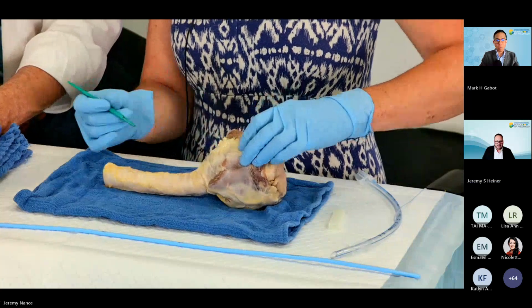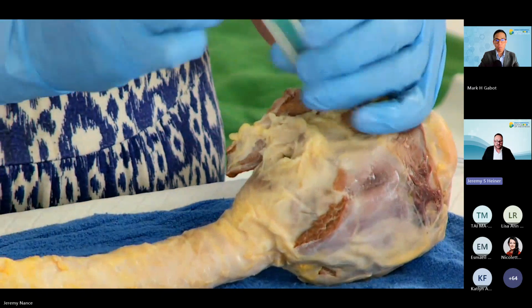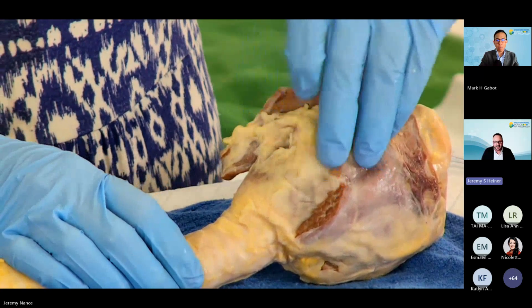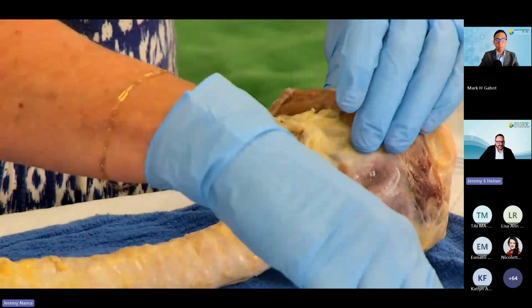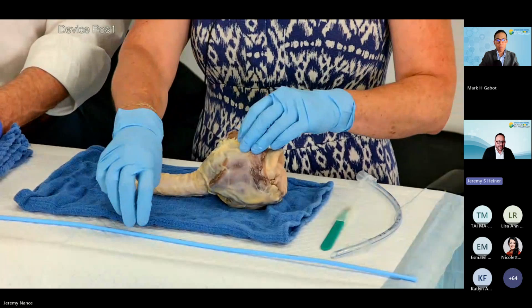You need a big enough incision to get your finger in. So go ahead and palpate now with the index finger of your non-dominant hand. And get that scalpel out of the way. The last thing we want to do is injure ourselves or anyone else. Now with that index finger, are you feeling all the way down the trachea, inside of the cricoid cartilage? Yes. Excellent. So we know that we're all the way through.